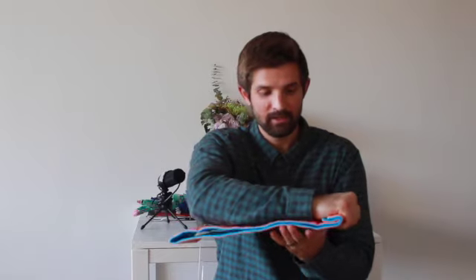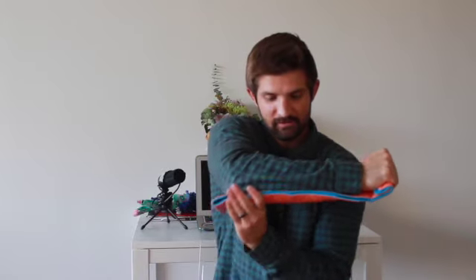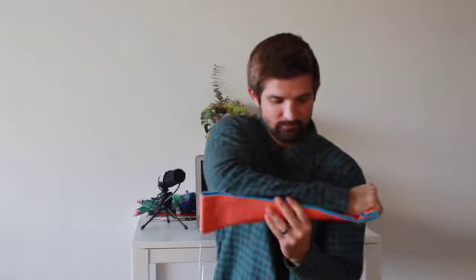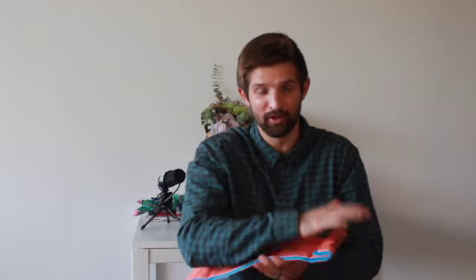What's great about SAM splints is they are moldable, so you can custom fit it to their arm to really hold that wrist in place. Your splint can be anything — for example, I broke my arm as a kid, my dad got a two-by-four, and we duct-taped my arm to it. And that worked fine. You have to be a little creative sometimes and that's fine.